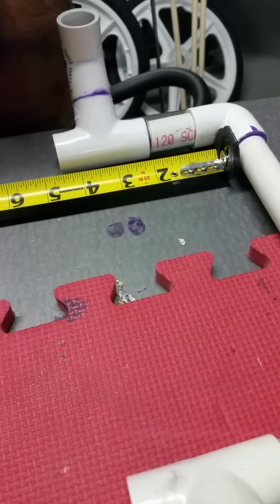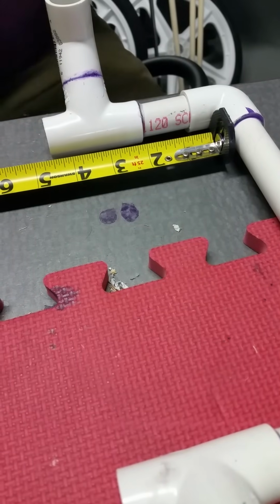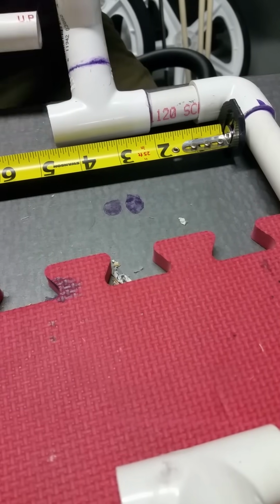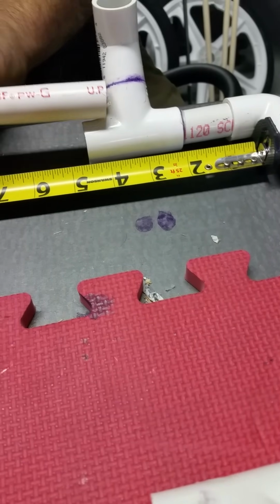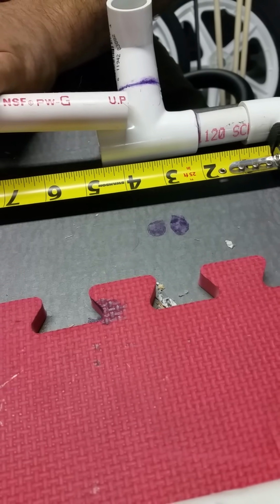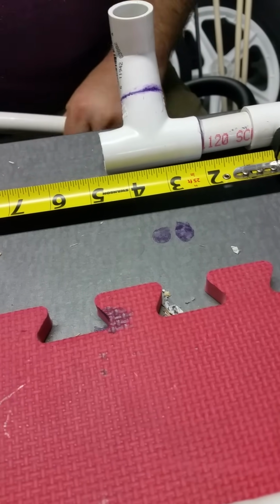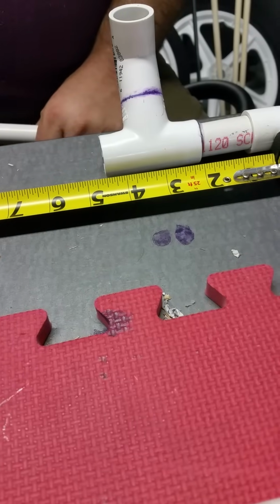If you look here, measuring how much pipe we have, roughly 3 3/4 inches of useful length, and then the fitting starts again, and we need to allow for the amount of pipe that's going to go inside that fitting. So you don't want to measure from the outside of the fitting. You want to leave a little bit of extra for the inside of the fitting. And then we're going to do the same for both sides, so everything will be symmetrical.